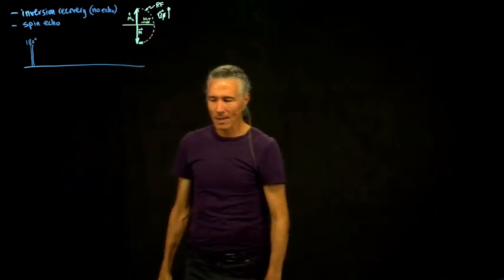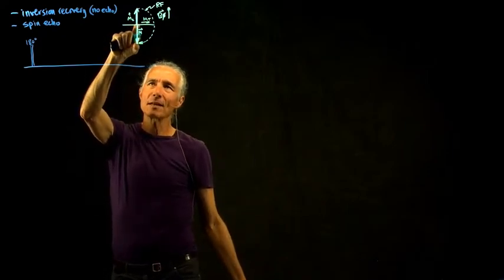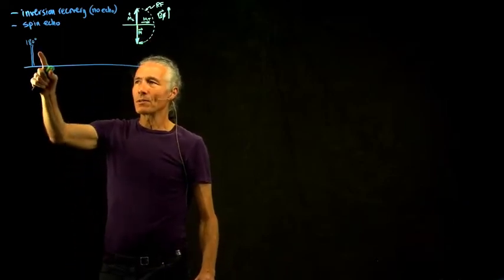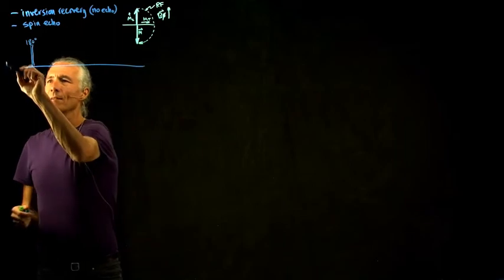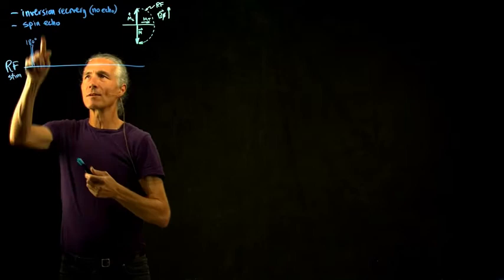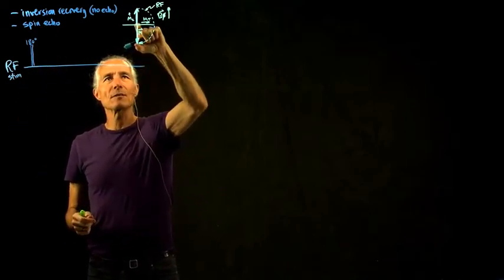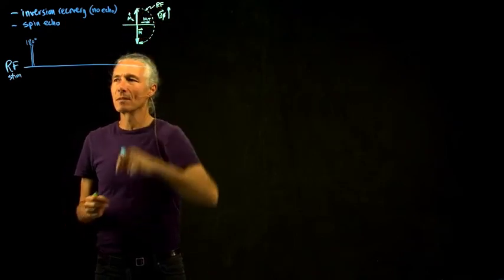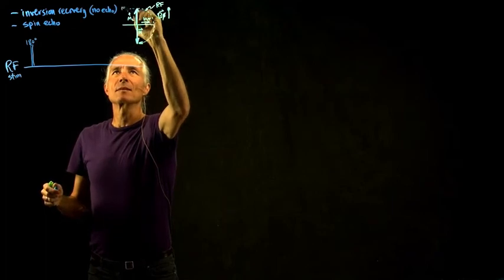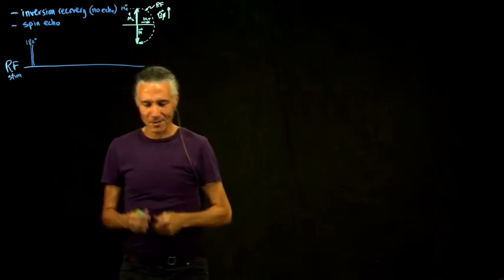If you do a perfect 180, and you nail it so that you don't end up overshooting or undershooting the RF pulse, then you won't get any signal. So during the whole inversion recovery, there's no signal because there's no transverse component. The vector just goes through 0 and then goes back up to the MZ0. Normally this would be the MZ0 that you would start with.